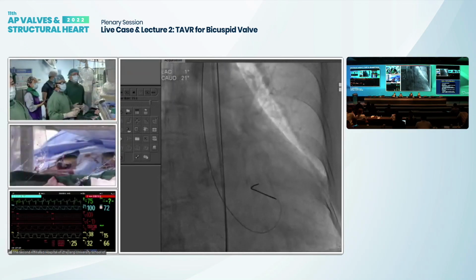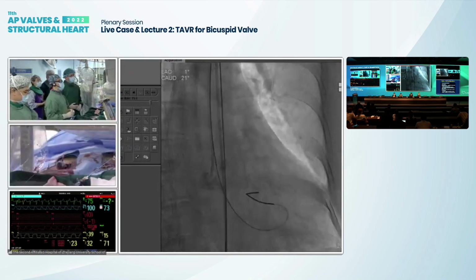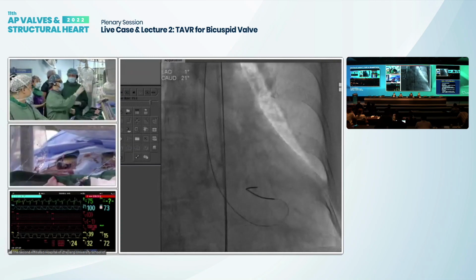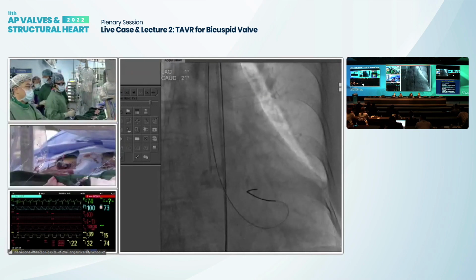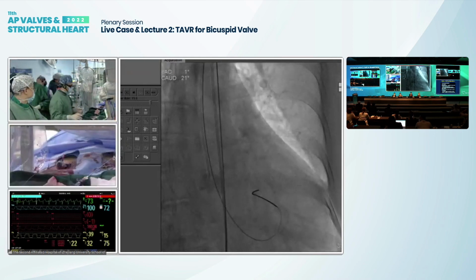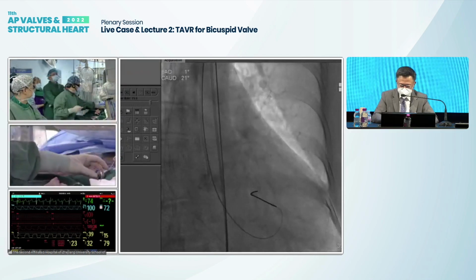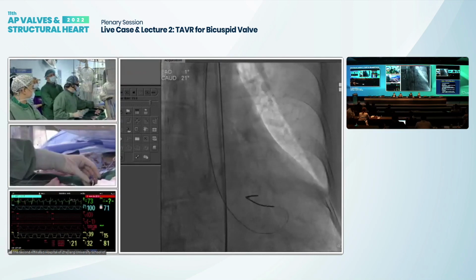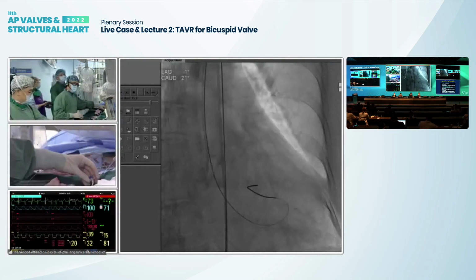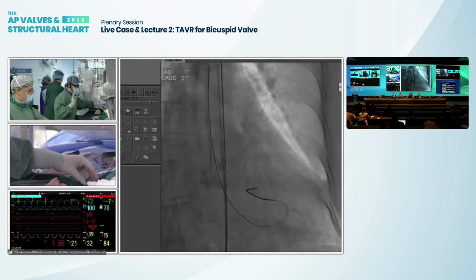So the patient now may have a severe regurgitation. If you're concerned, you can pace the patient at a slightly higher rate to decrease the diastole. But the pressure's okay, right? Hemodynamics is quite stable. So it should be okay without the pacing.